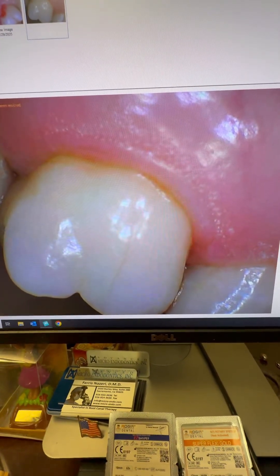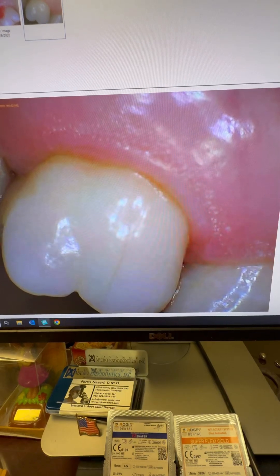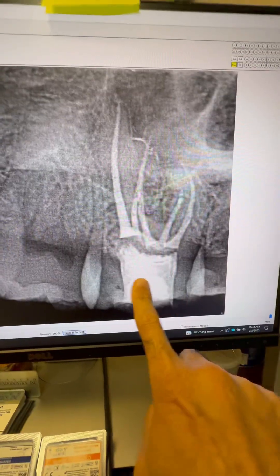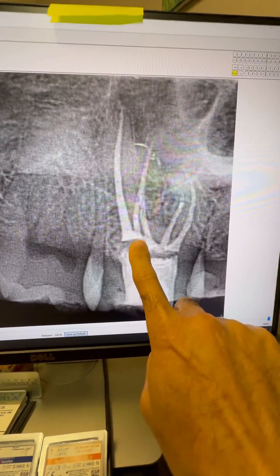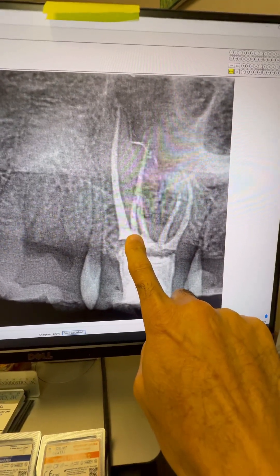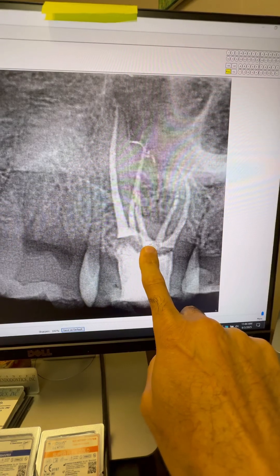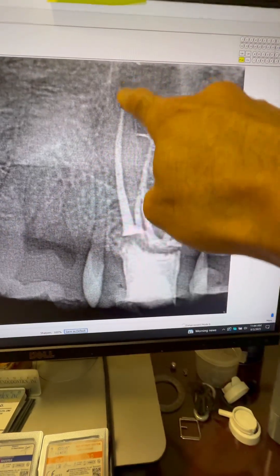So today we went ahead and did the root canal for her. Here's the post-op: MB1, MB2, DB1, DB2, and palatal.